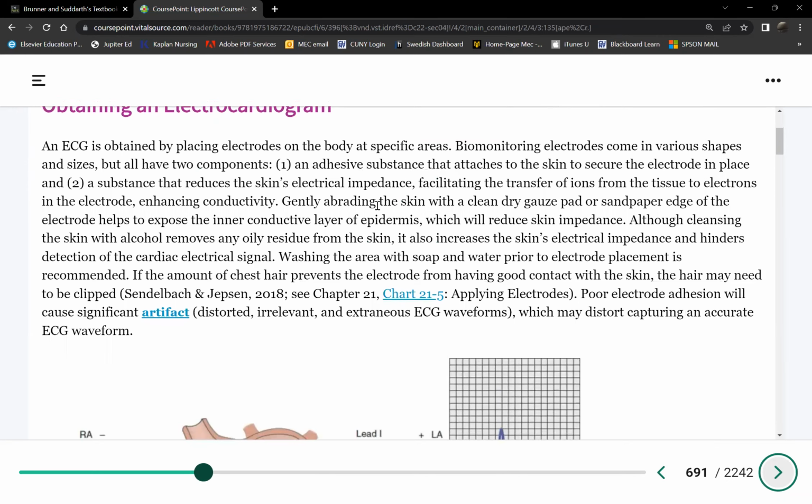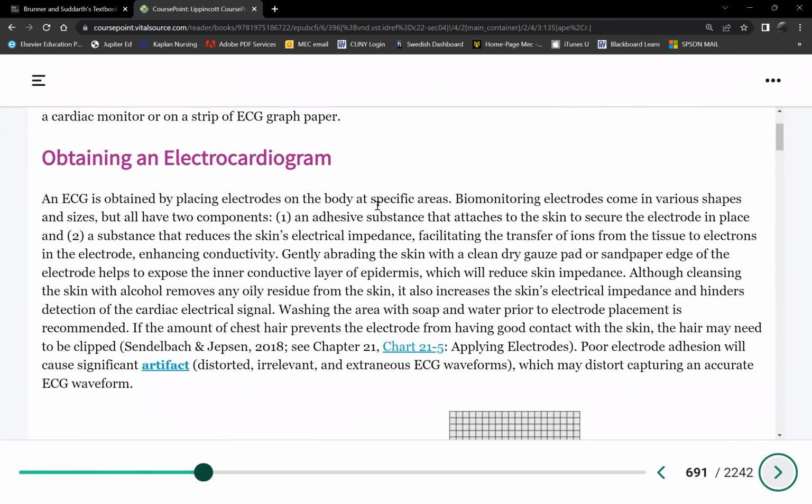Let's talk about the ECG. ECG, the minimum here is a 12 lead ECG. There are, of course, 1 and 6 lead ECGs. However, in order to make a complete diagnosis of a patient's dysrhythmia, a doctor will require a 12 lead ECG.